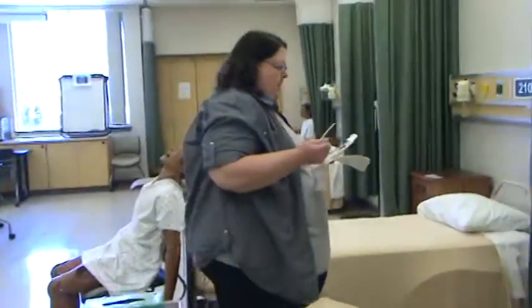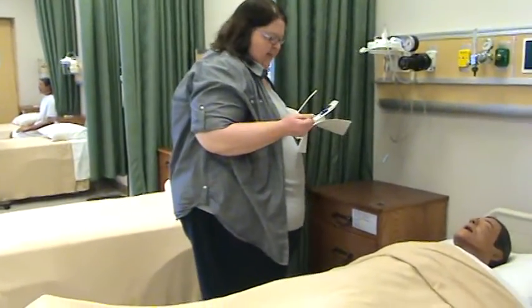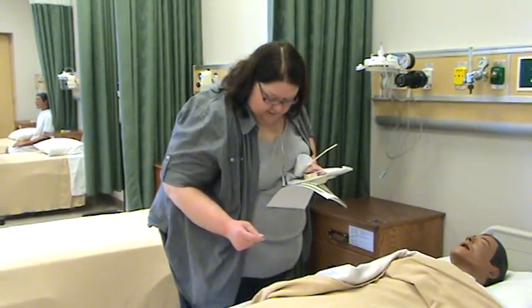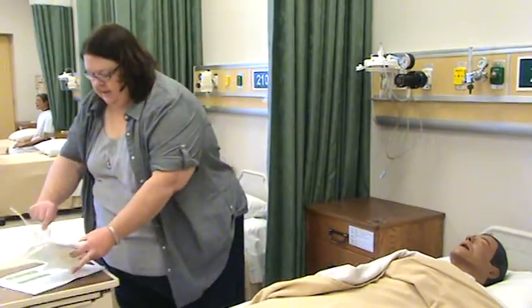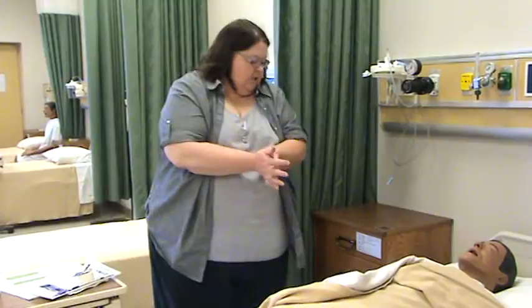Hey, Mr. Pooh, how you doing? Can you pop your arm out of the covers there so I can identify you? Winnie the Pooh, 1929, 569. Perfect.